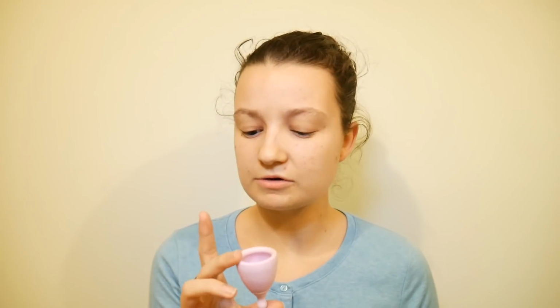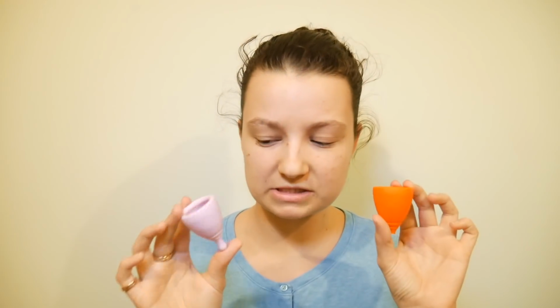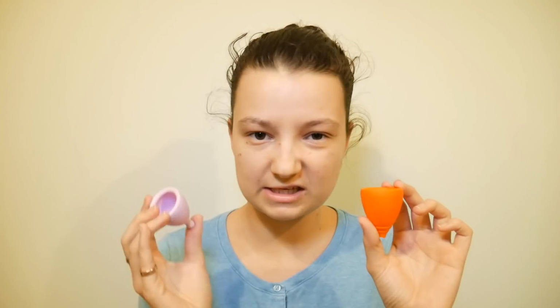And I've cleaned the holes as well with one of those little interdental brushes, but I just can't get it out. So I don't know if that's just the material itself, whether TPE is more prone to staining than silicone, but that was one thing I noticed. So just one thing I thought I'd point out. But the orange cup doesn't seem to have had this as much. This one seems to have been fine, so maybe it's just because this is the lilac colour. Who knows? But again, it doesn't affect the use of the cup if it's stained, so it's just something I thought you should be aware of.